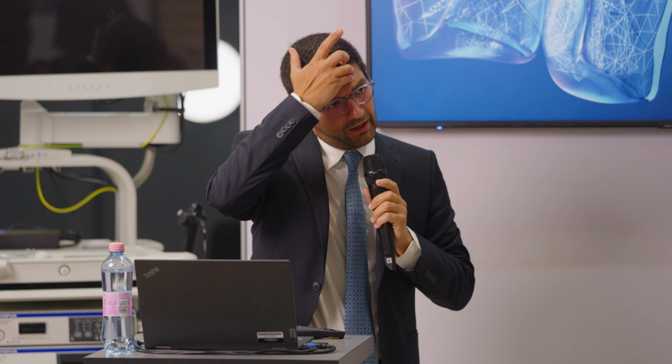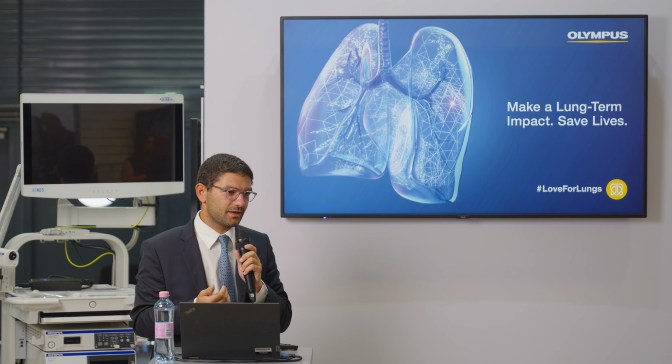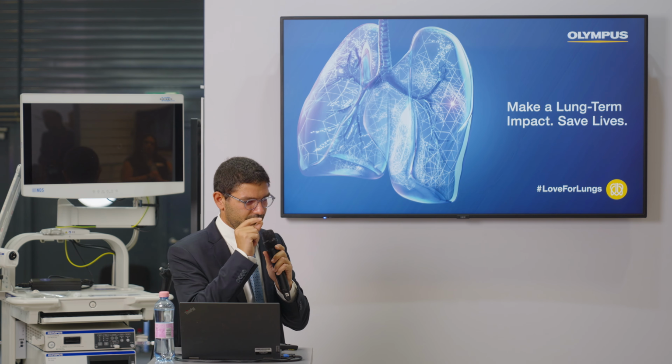I think that the Ultraslim scope, the radial probe, and the cryobiopsy tool give the best diagnostic yield with the lowest cost. Now, without CBCT, the main problem is the tool in lesion, the last 1 centimeter. If you have the CBCT that is shared with other specialties, that would be great.